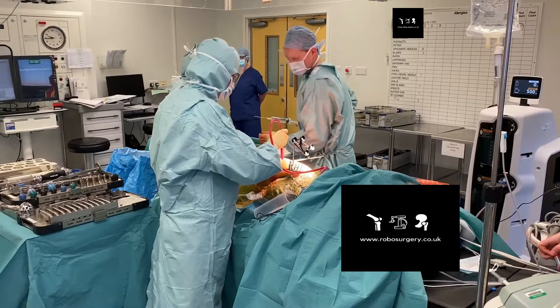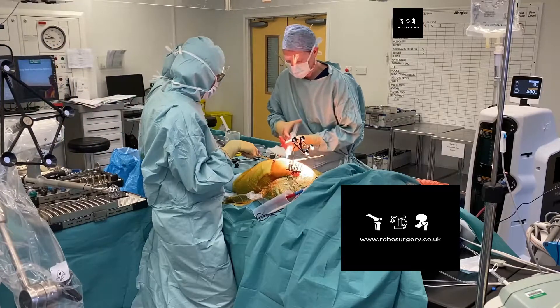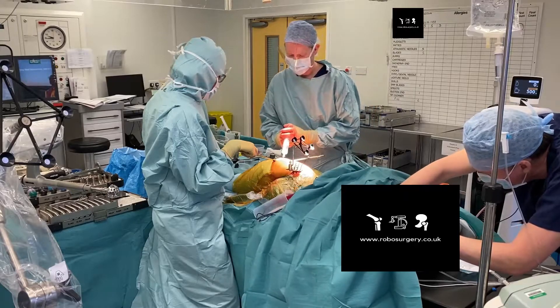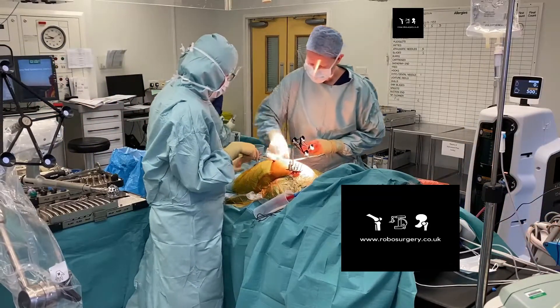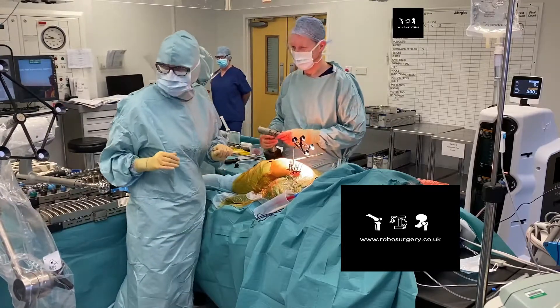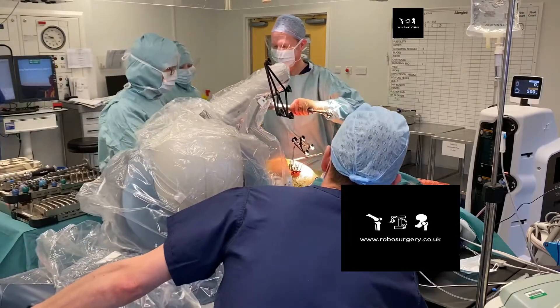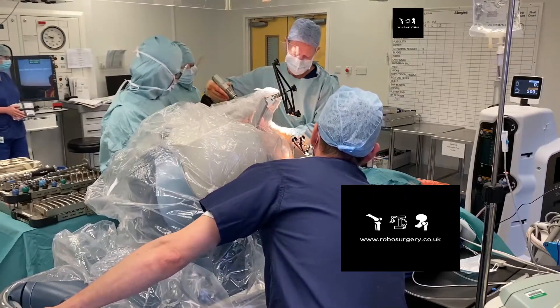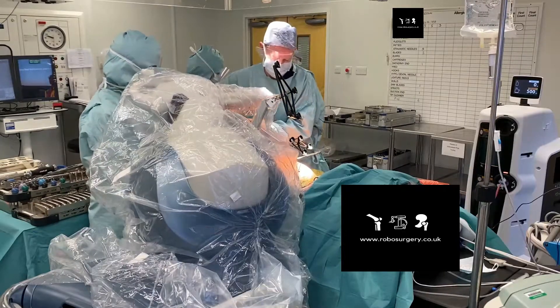After we've referenced the acetabular side, I infiltrate the wound with local anaesthetic — most of it going into the anterior capsule but also around the acetabulum. The robotic arm has already been preloaded with a 48 millimetre reamer as per the pre-operative plan. We have the 48 millimetre acetabular component ready and waiting, and quite commonly I'll open the implant before we've even reamed, as it's very rare that we would change the size. The reaming system is accurate — it allows us to ream with one pass, so a 48 millimetre cut with one 48 millimetre reamer, and the robotic arm guides me in the right trajectory to allow that one pass.